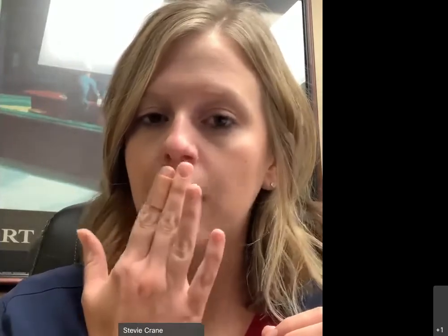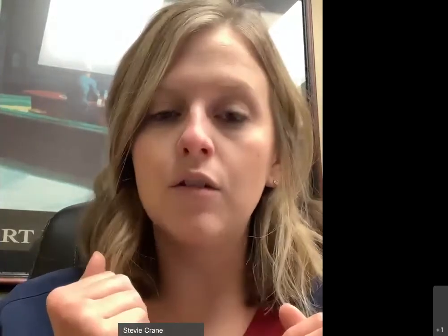Over the years, these masks have been constantly improving. So if you were diagnosed quite a while ago, even a couple of years ago, the masks have changed since then. Everyone now is all about doing something real light underneath your nose, minimal headgear, all great working masks. So as far as the CPAP, like I said, it blows out air to keep your airway open.